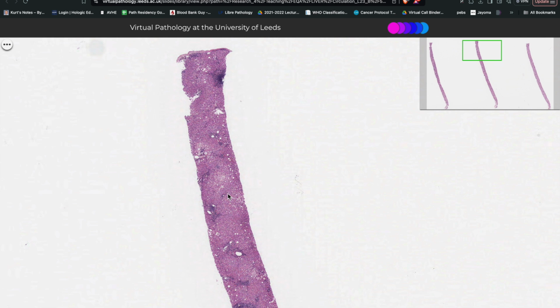And so for this case, this 45-year-old female has a raised ALT of 187, raised IgG of 26.6, and ANA is positive, suggesting an autoimmune element. She has been previously on treatment for breast cancer in 2020, including tamoxifen, which has been shown to lead to macrovesicular steatosis of the liver. Alk Phos is 125, bilirubin 7, albumin 34. And here's a liver core biopsy.